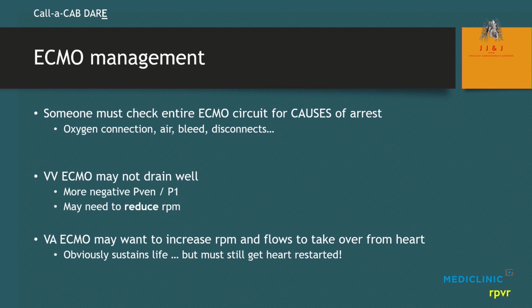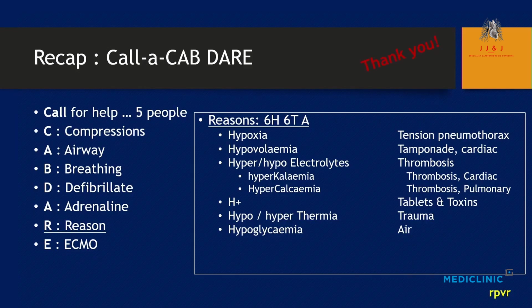Okay, now I think it's the last slide coming up, which is just a recap of the same things. Have a sequence, do something, whether you like that scheme or something else, who cares, but work in sequence. Think of the causes and try and reverse it to try and get your cardiac arrest patient back.